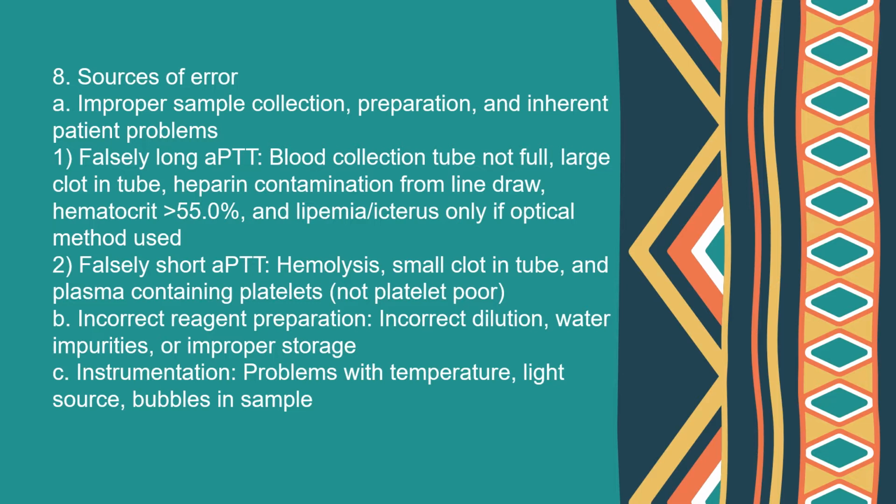So this is something to do with the personnel being unable to perform properly. Okay, it can also be because of water impurities. So there may be something in the water that we use, so we have to make use of distilled water. Improper storage, so that can also be a problem.